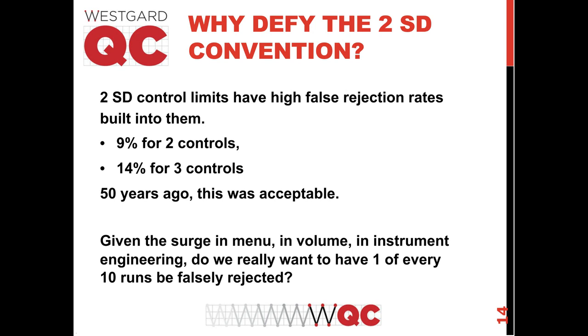50 years ago, there weren't that many tests. The runs were small, the menu was small, so if you had 1 out of 10 runs out of control, it was something you could manage. But we have a huge volume of tests. We have a huge menu. We have more and more instruments.